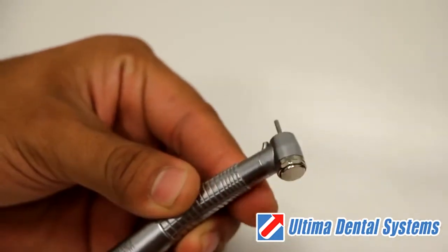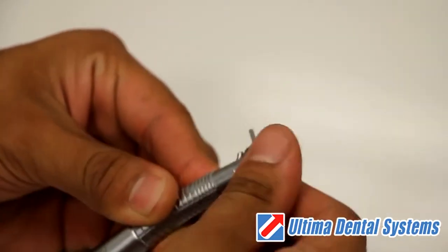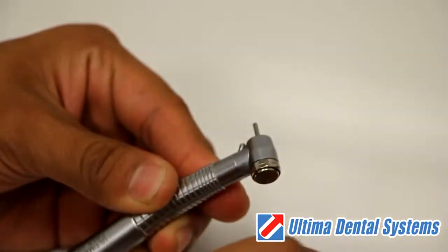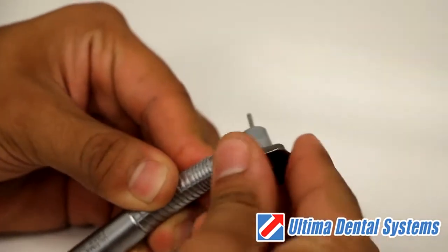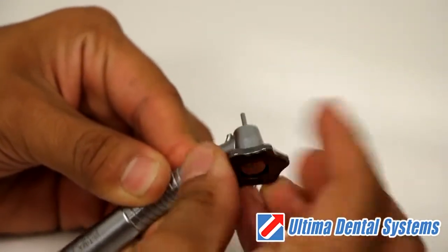Using the start tool that was supplied with the purchase of your high-speed handpiece, carefully remove the handpiece end cap, making sure not to strip the end cap threads.